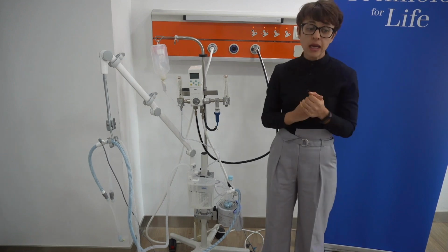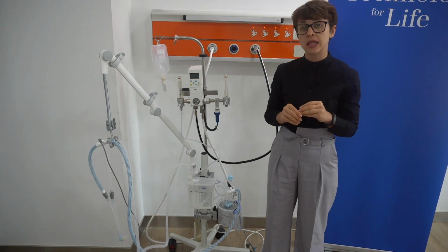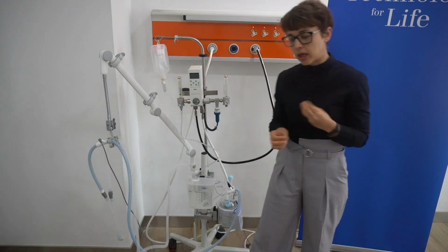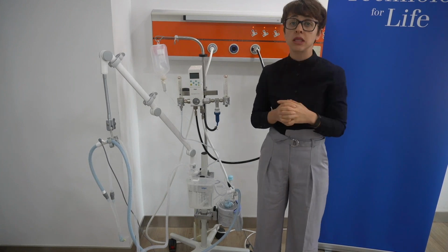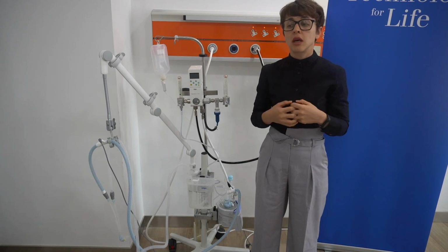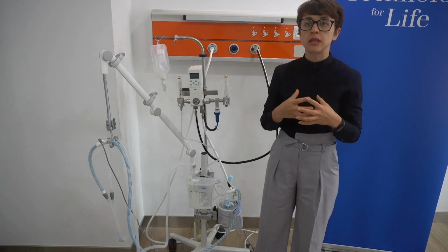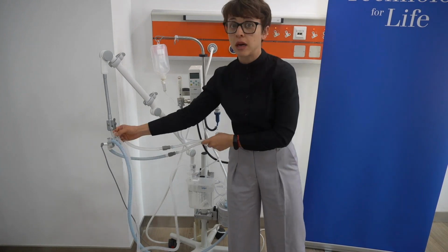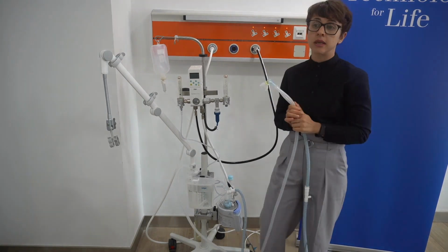I think it's also quite important to say a few words about the interface during the CPAP therapy. So Linda was mentioning, and we had this question as well, about the sealing of the mask onto the patient's face, and that in neonates it is particularly difficult because of their not fully developed features, and also because the masks are not soft enough to fit properly into the neonate's face.